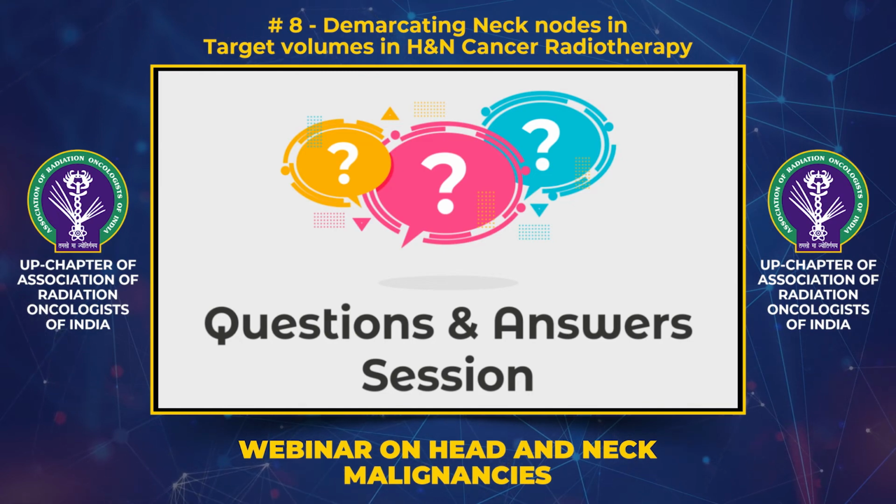Yes, ma'am. Dr. Lakshmi is asking that if there are multiple subcentimetric lymph nodes whose summed long and short axis diameters are more than 17 millimeter, should we contour all the subcentimetric lymph nodes separately in the gross tumor volume? No, ma'am. Based on the paper that I have quoted, published in the Red Journal, they have said that it is not required to contour each of the nodes individually and take a 1 centimeter margin around them. But the whole lymph node station has to be taken into account.